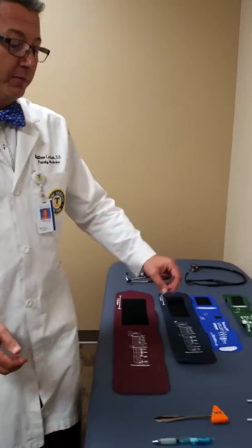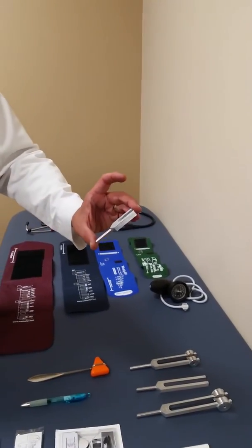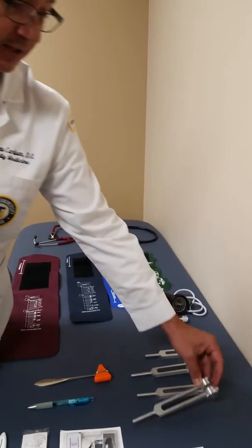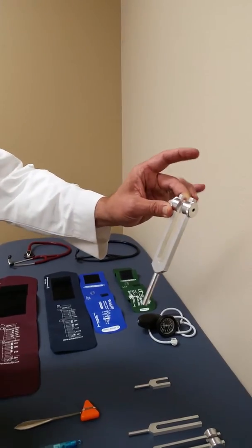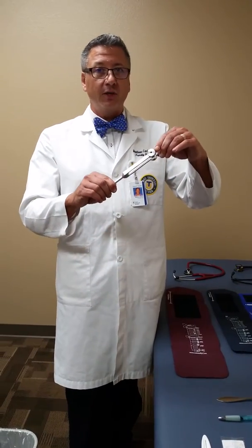Our next piece of fun equipment is our tuning forks, ranging from 4096 Hz down to 128 Hz. The one we're going to most commonly use is the 256 Hz fork. To activate it, some people smack it on their palm or on a knee, but personally I just snap my fingers on the end of it — it gives a good tone without smacking anyone.